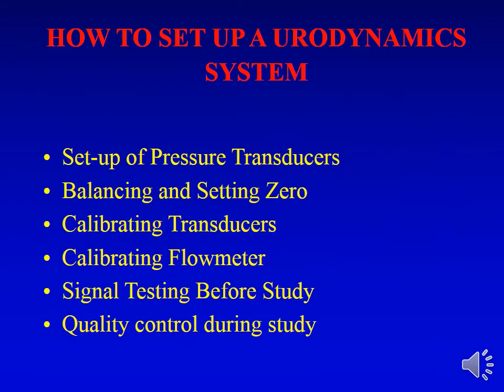How to set up a urodynamic system? Most important, one needs to attend a workshop to know. What we need to know is to set up pressure transducers, balancing and setting of zero, calibrating transducers, calibrating the flow meters, signal testing before the study, and very important, quality control during the urodynamic study itself.